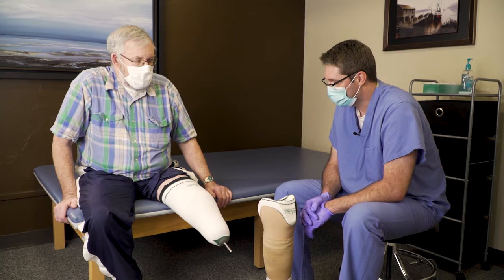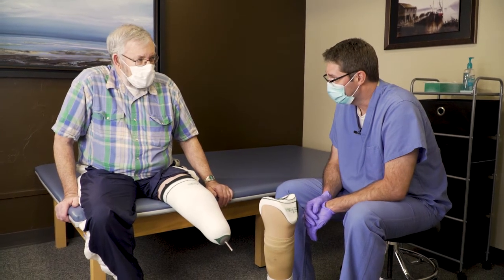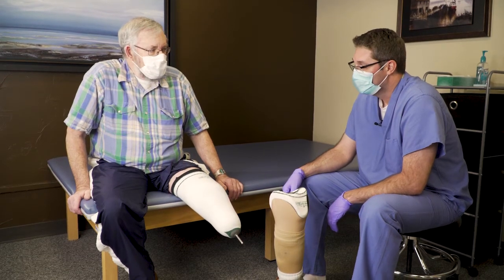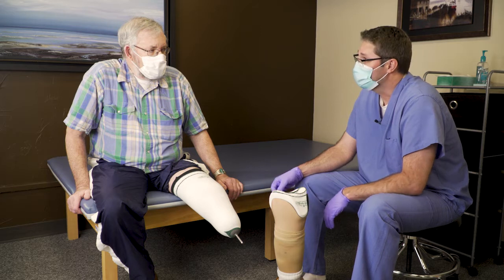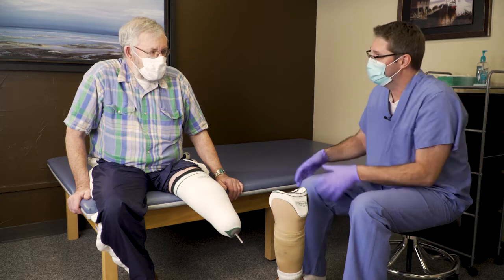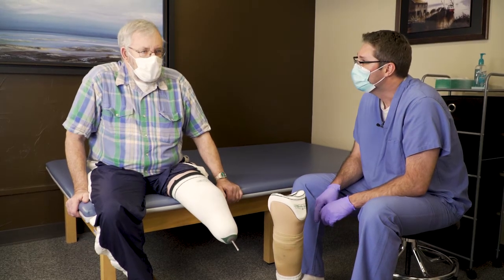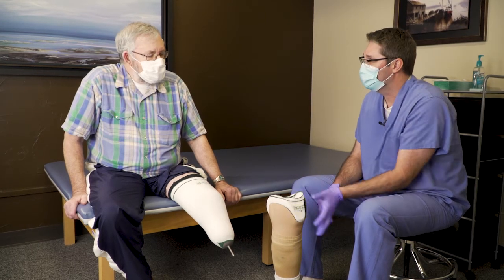Well, thanks a lot for coming in today. No problem. So how long have you worn a prosthesis? 21 years. Now, have most of them had the pin? No. Okay. So when you switched to the pin years ago, it was because it was farmer friendly, wasn't it? Right. Some of the other systems rely on an outer sleeve to suspend the prosthetic, and what would happen with that? Well, you'd sweat in that and then it'd slide down and you'd take a step and you're out of it.